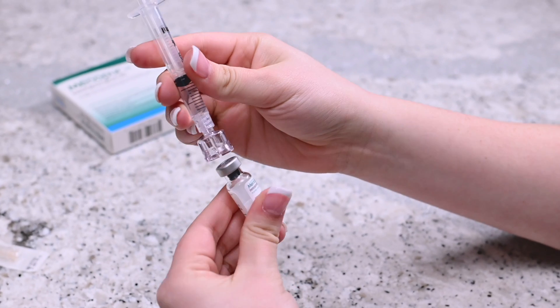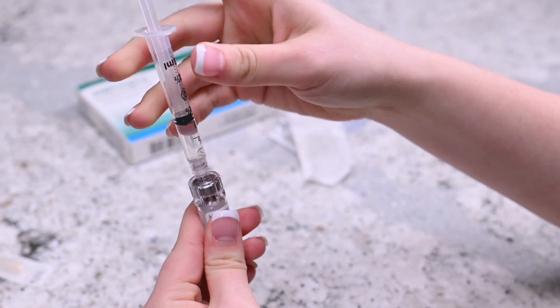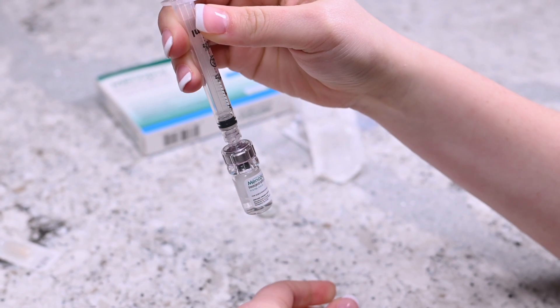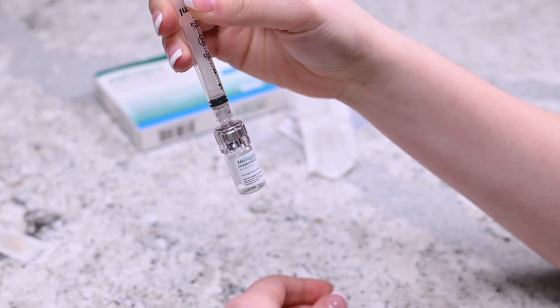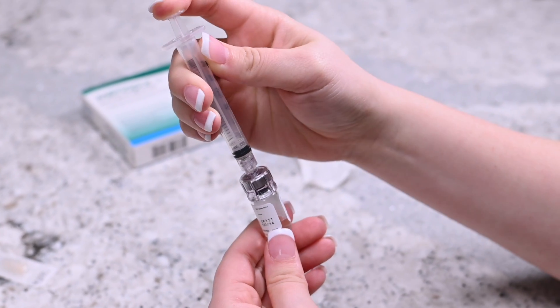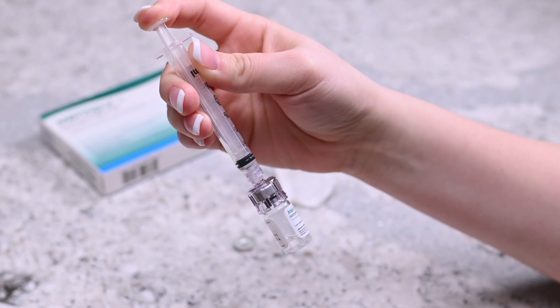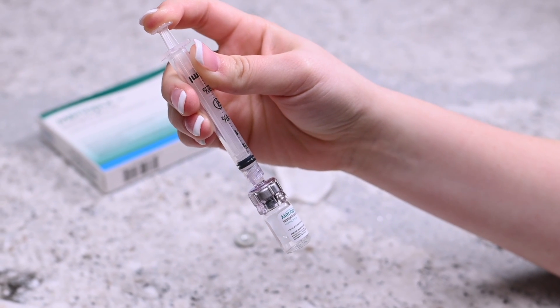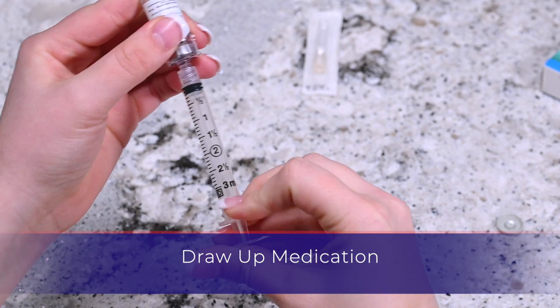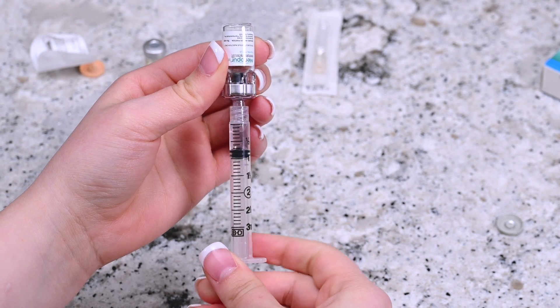Remove the cap from the second vial of Menopur. Insert the q-cap into the rubber stopper on the second vial of Menopur powder and release the syringe's content into it by pressing on the plunger. After releasing all the liquid into the vial of Menopur powder, gently mix the contents while it is still attached to the q-cap and syringe until the powder dissolves. Do not shake the vial. Invert the syringe without removing it from the vial and pull the plunger back until all the contents from the vial transfer to the syringe.